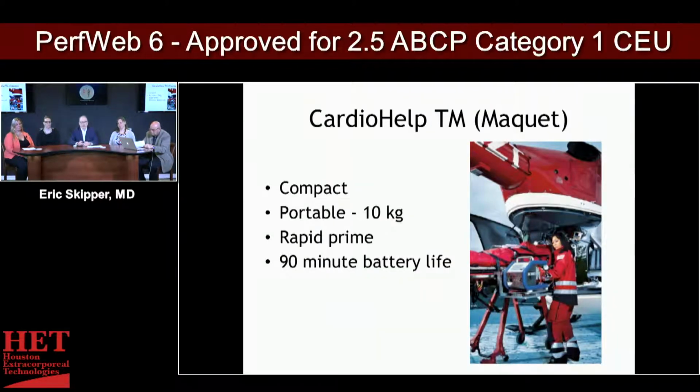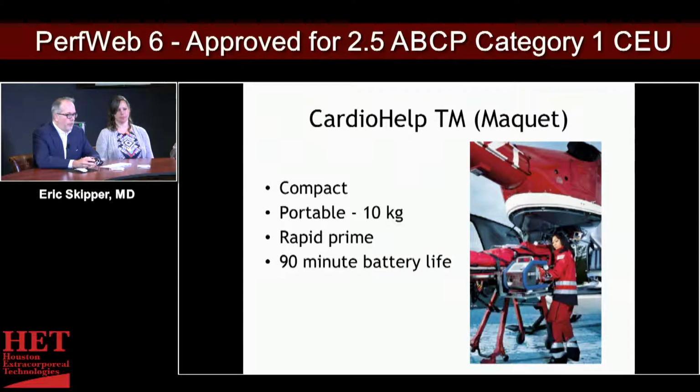There are ECMO circuits designed for transport and/or ease of use. This shows the Maquet CardioHelp system. It's compact. It weighs about 10 kilos. Rapid prime. Basically follow the instructions and you can be primed in less than 5 minutes. And it has a 90-minute battery life.